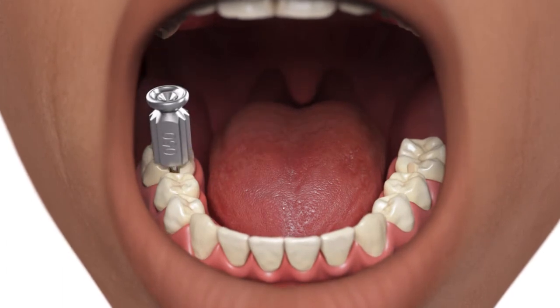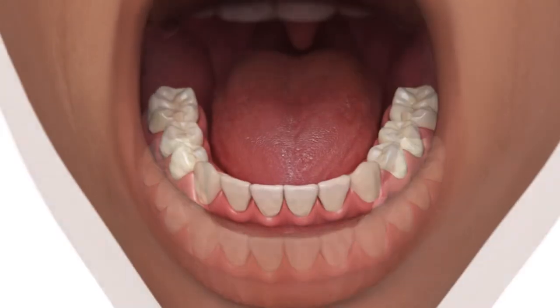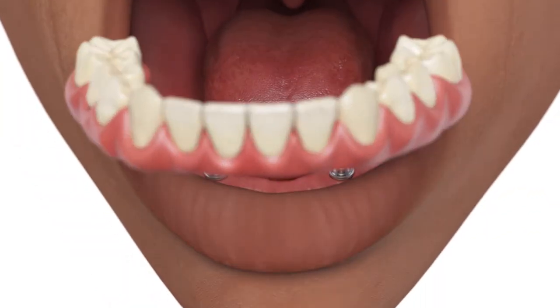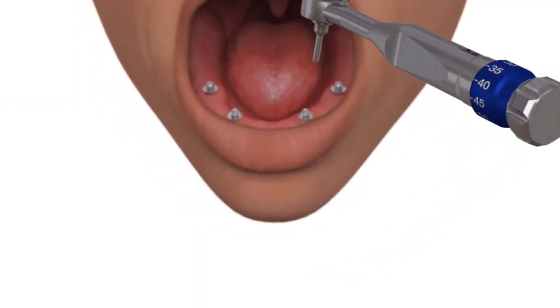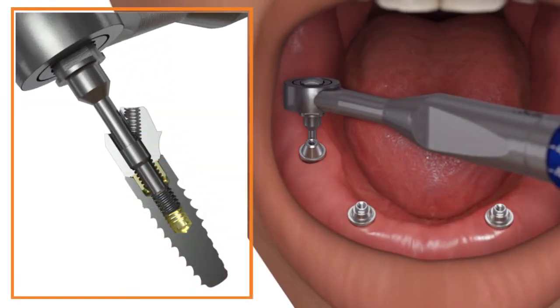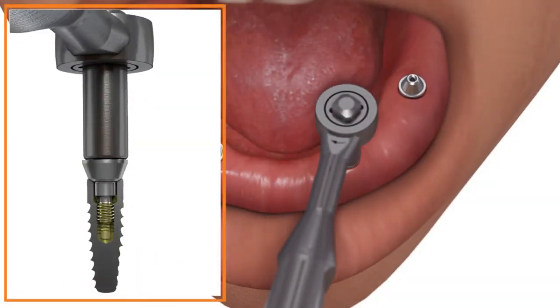Remove the provisional restoration and confirm that the abutment platforms are free of any debris or soft tissue. Tighten the multi-unit abutments or abutment screws to 30 Newton centimeters using a calibrated torque wrench and the appropriate driver.